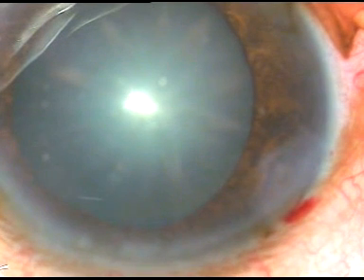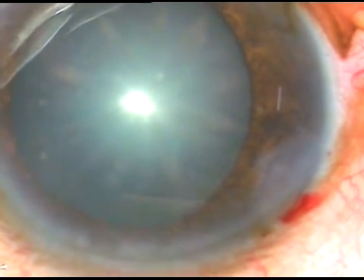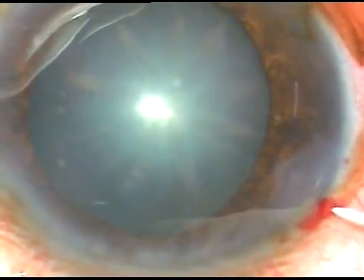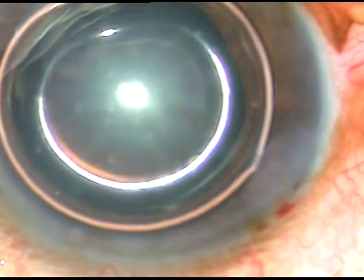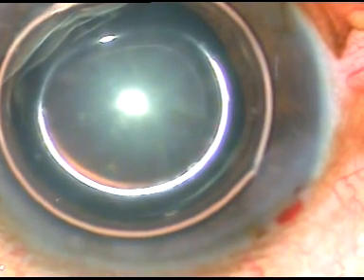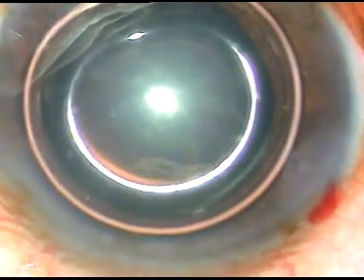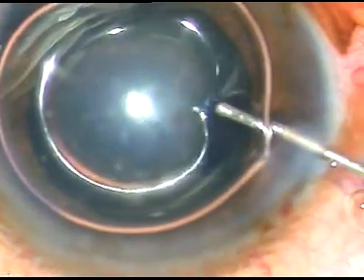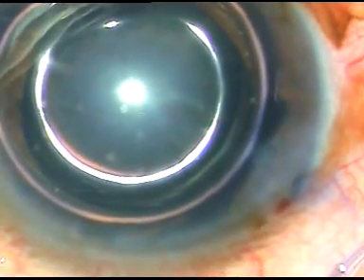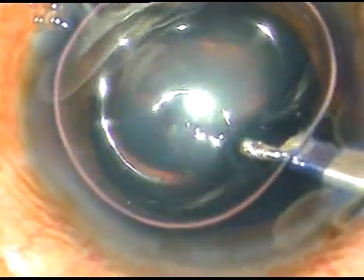Now I want to stain the capsule with trypan blue dye so that I can easily identify the anterior capsular rim. When a CTR has to be placed, identification of the anterior capsular rim will be helpful. So the anterior capsule is stained with trypan blue dye and the dye is washed out.